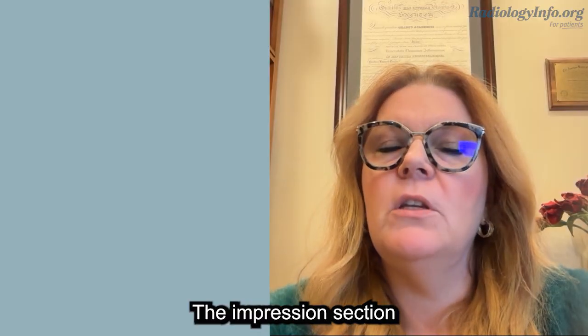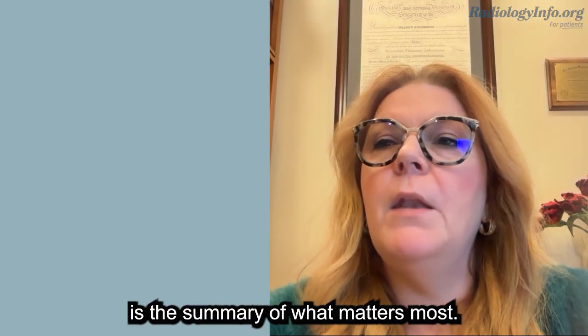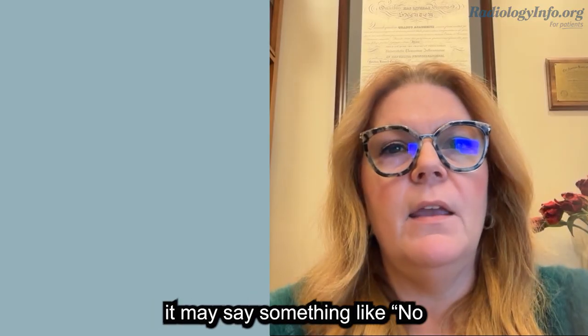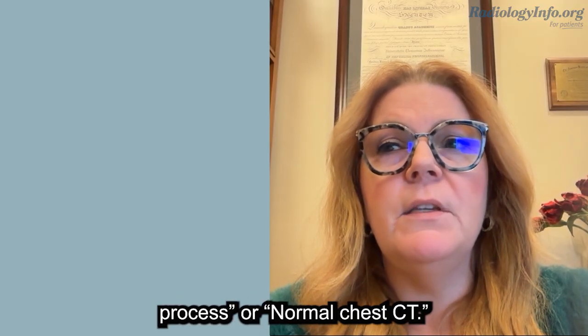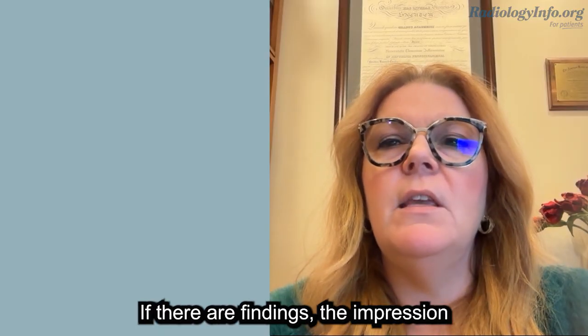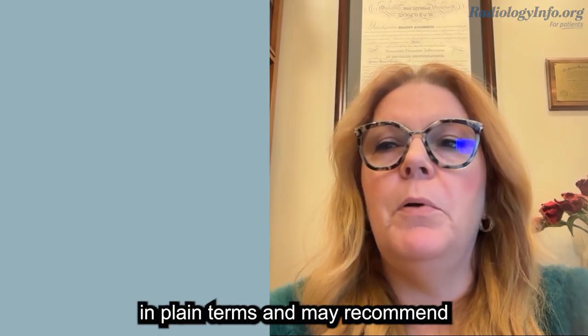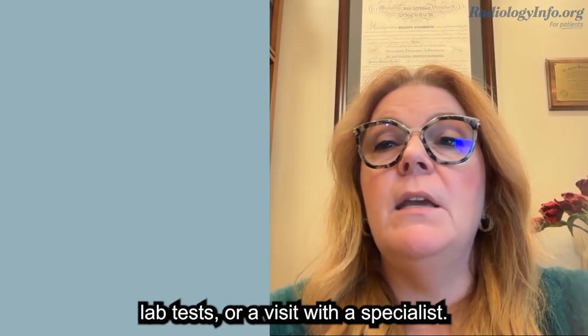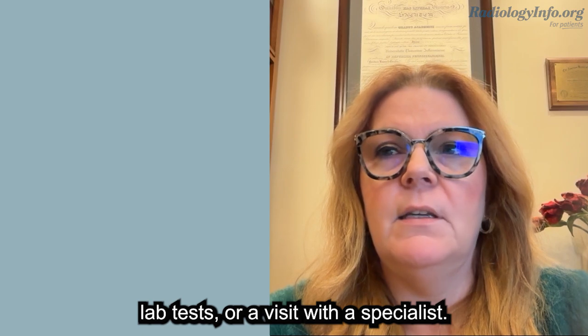The impression section is the summary of what matters most. If everything looks normal, it may say something like no acute cardiopulmonary process or normal chest CT. If there are findings, the impression pulls them together in plain terms and may recommend follow-up imaging, lab tests, or a visit with a specialist.